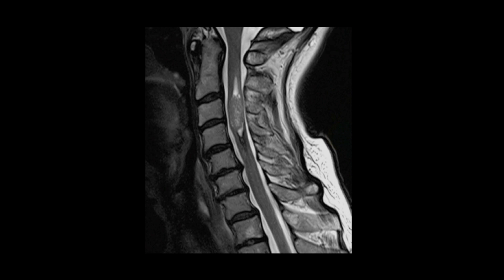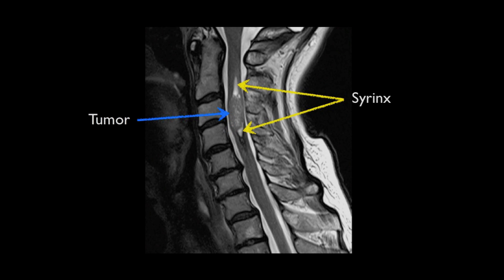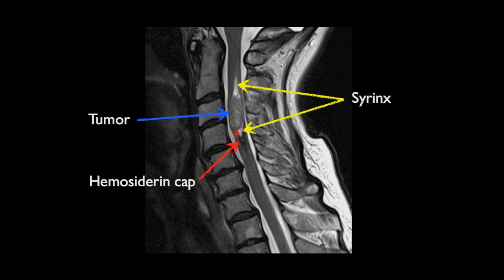The morphology of ependymomas is best appreciated on sagittal images. It is composed of the tumour itself, located centrally within the cord, and is often associated with an adjacent syrinx extending above and/or below the tumour. Characteristically, these lesions have a tendency to bleed, and as a result, hemosiderin staining at one or either end of the tumour is common. This is known as a hemosiderin cap, and although not pathognomonic, it is certainly very suggestive of this entity.